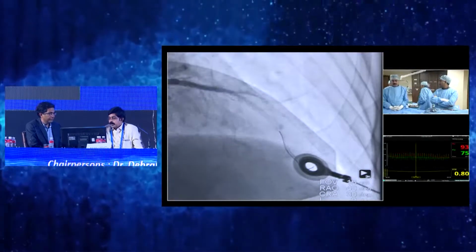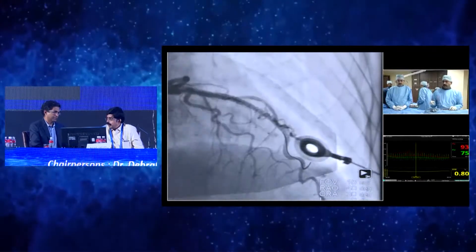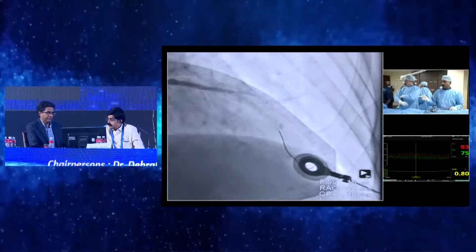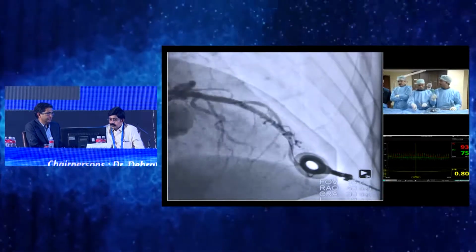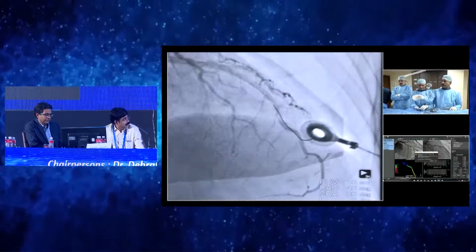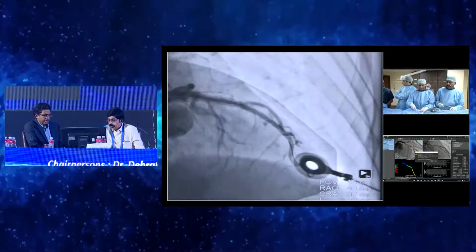Transfer the images. Can I show you the setup, how it is arranged? Now we took the pictures, as Ramesh you asked, and we'll do the post-stenting QFR immediately in front of you live. Sure. This is a picture, are you able to see the lab as such? The screen is arranged here, FFR is here, and to the right of it is the QFR calculation of values.